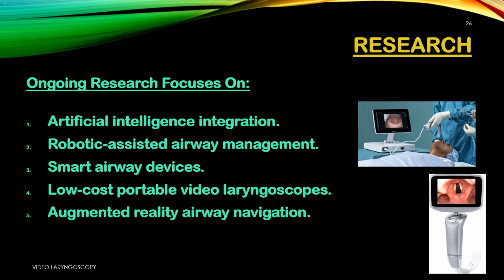Research. Ongoing research focuses on: 1. Artificial intelligence integration. AI can detect vocal cords and predict difficult airways in real time. Helps guide less experienced users. 2. Robotic-assisted airway management.